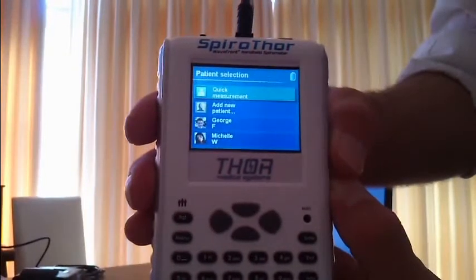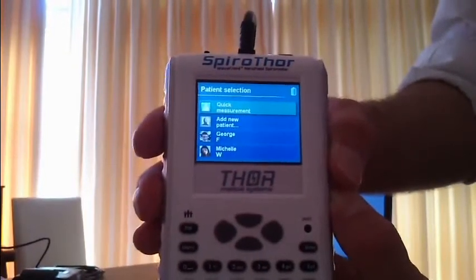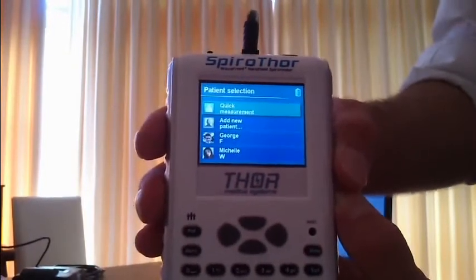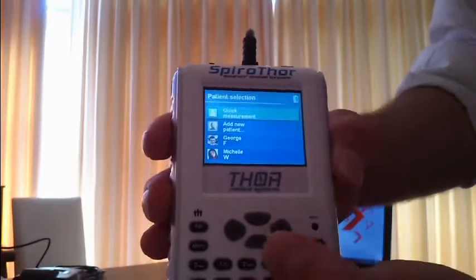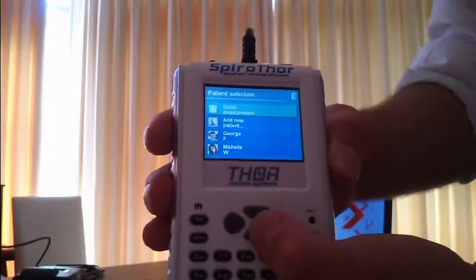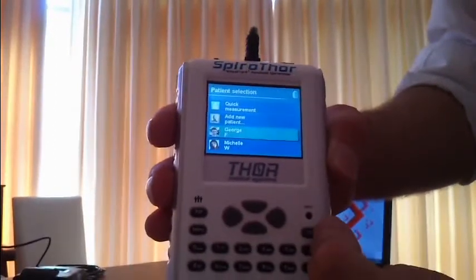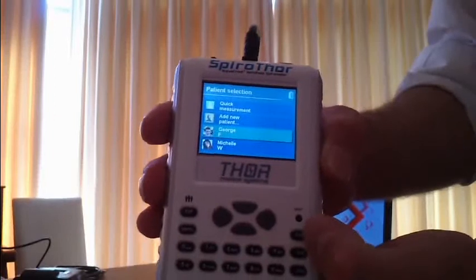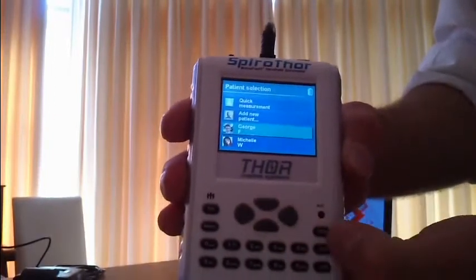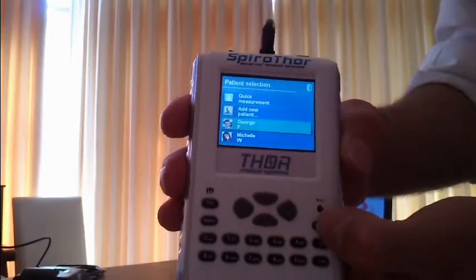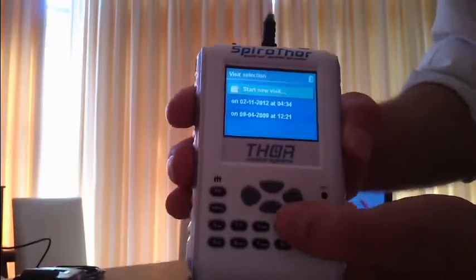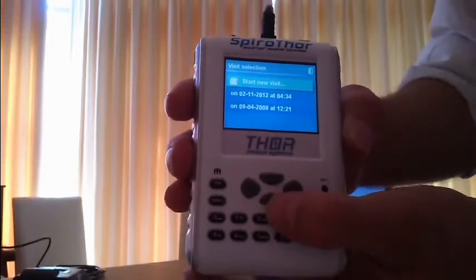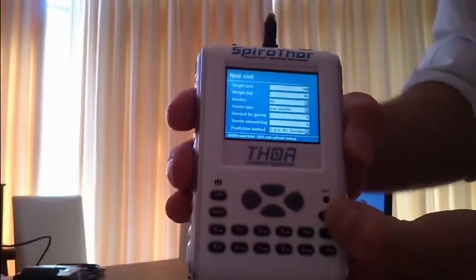For the first time when you start the device, you'll see a setting where you have to set the date and time. But you can select an already existing patient by using the buttons up and down. You can hit enter, select the patient, and then it's better to start a new visit.